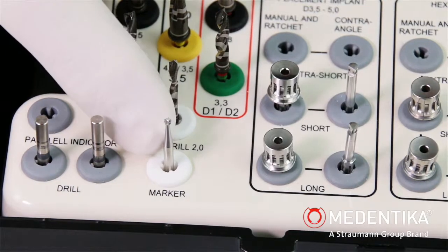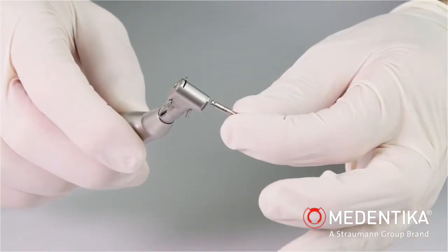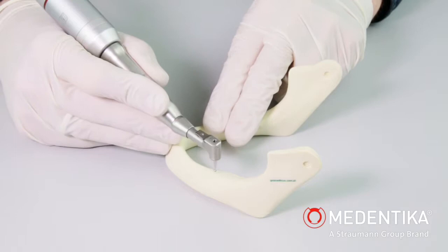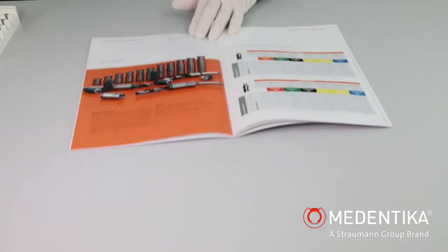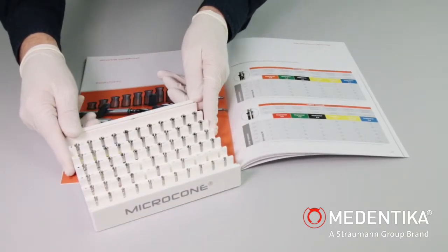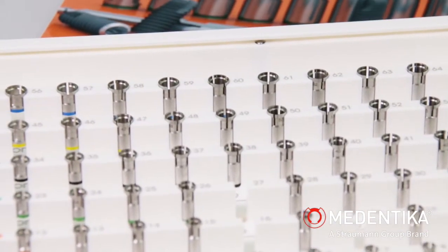A point is prepared at the implant site using a round burr with a diameter of 1.8 mm. Depth stop sleeves are used for all further drilling sequences for preparation of the bone site. The microcone depth stop ensures precise control of the drilling depth when preparing the implant site.